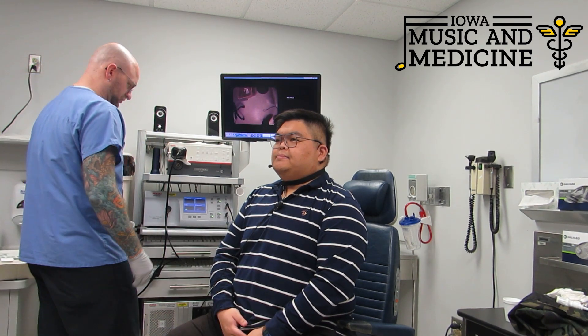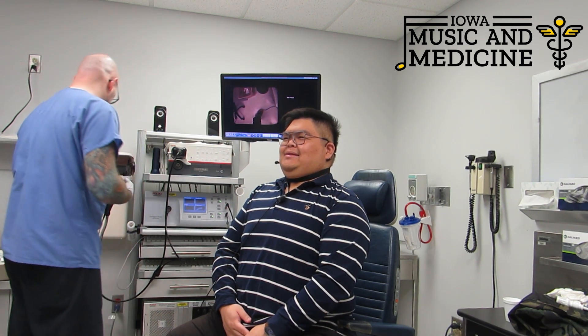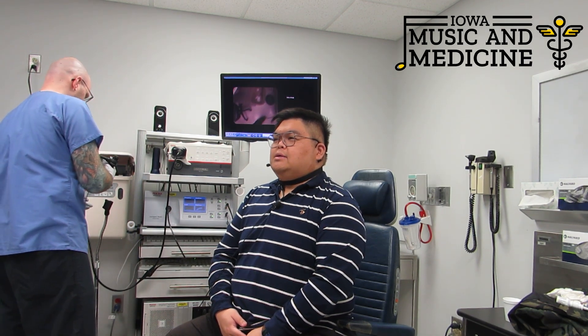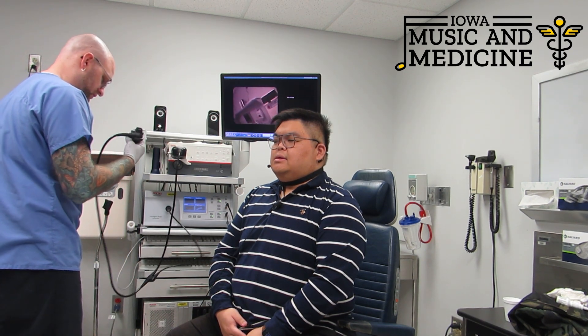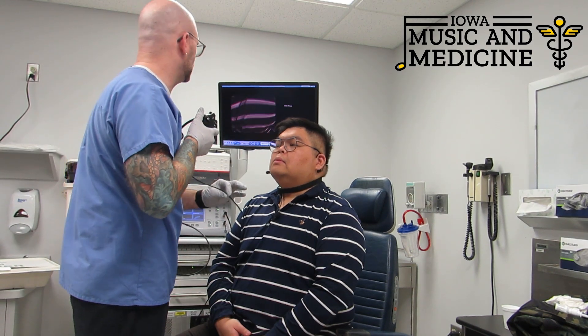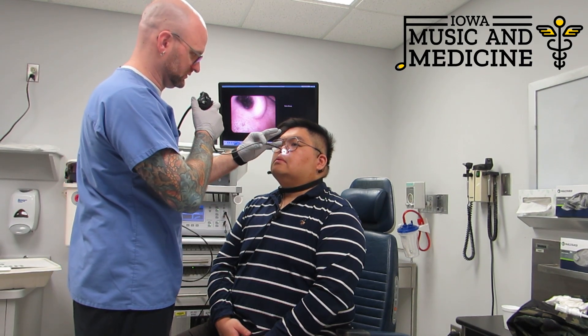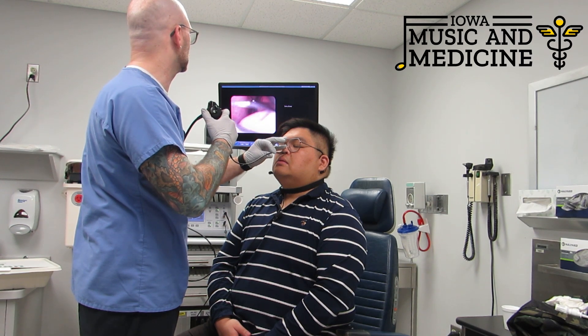The big thing to remember is to breathe. In and out through your nose is best, at least for the first part as we're placing the scope. Once we get into place, you can breathe through your nose or your mouth — it doesn't really matter. So just stick your chin up just a little bit for me. Perfect. And just breathe nice and easy.